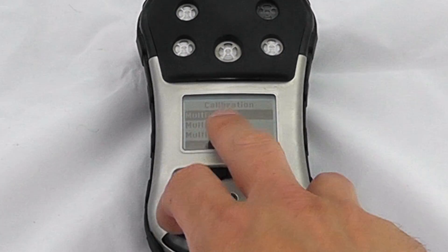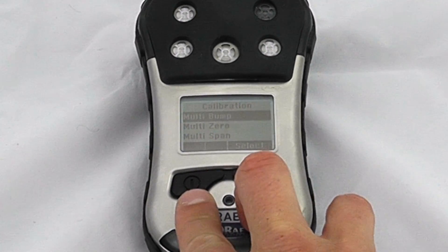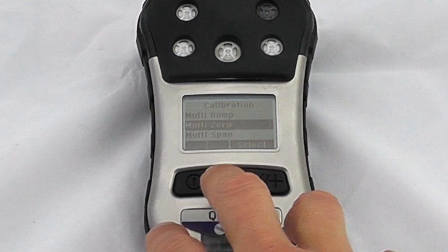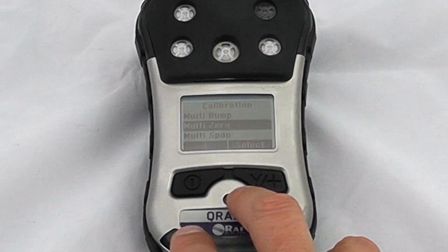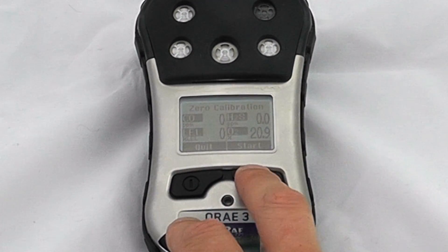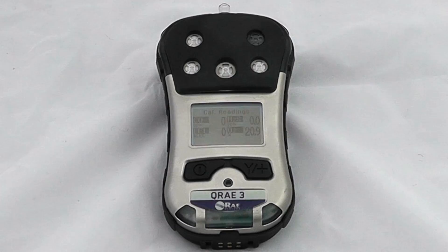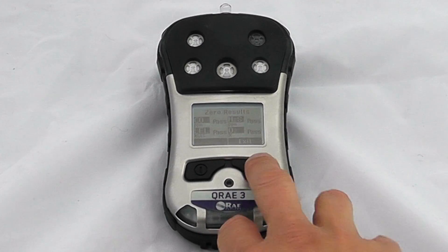To start the calibration, we can do a multi bump if we want to log that for data integrity. We'll start with the first point of our two-point calibration, which is a multi-zero — this will do a zero calibration on all sensors. It's a 30-second countdown, and you should always have a clean atmosphere. If you suspect any contamination in the background, I would suggest using a carbon filter on the device.